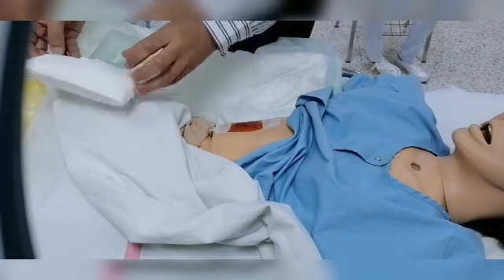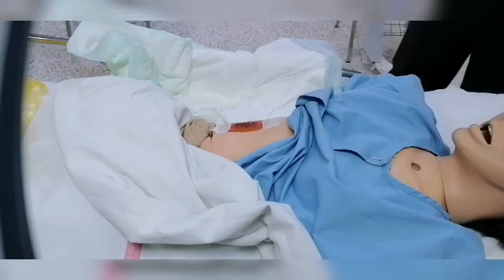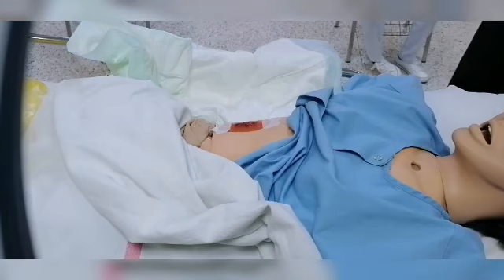Then I will open the dressing set without touching it with a bare hand. So I can use what we call the non-touch technique for opening it. So I just open it from outside.